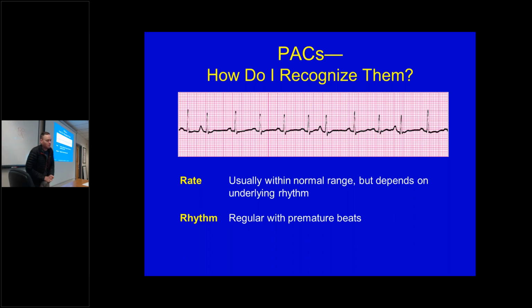Would it be wider if it originated on the sidewall, like that? I don't know. It might be. This has to do with the direction it travels to that lead. Right. It's showing that direct path, it should be spiking bigger. Exactly. If it's showing a horizontal, it's coming out, flattening out.